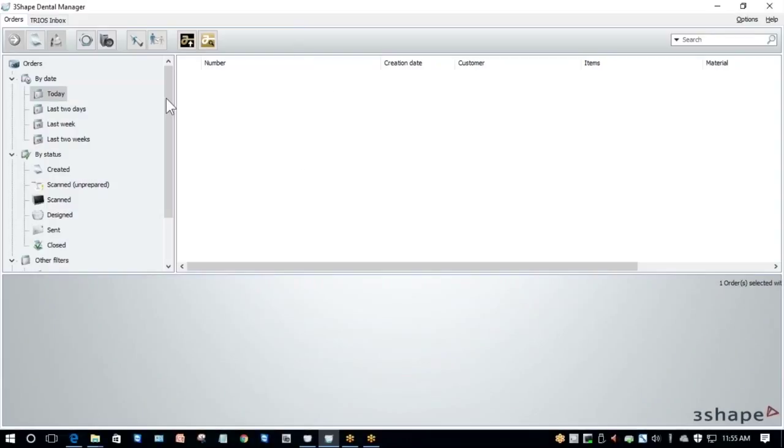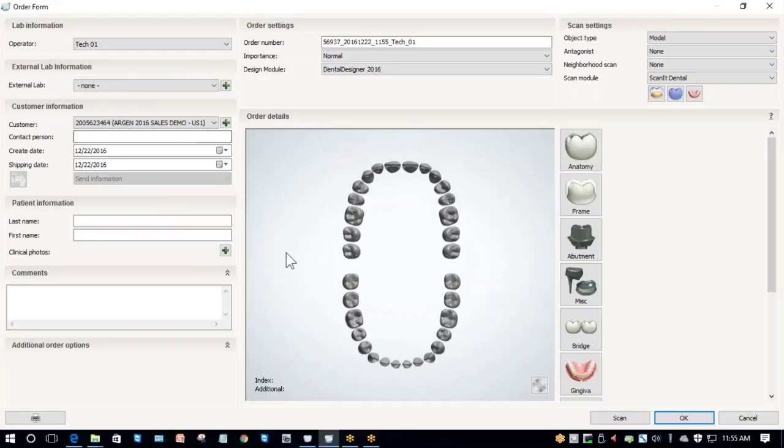So the first thing we're going to do is create a new order for a crown. To do this, I need to click on the new order icon on the top left that looks like a blank sheet of paper. When I click on that, it opens my 3Shape order form.